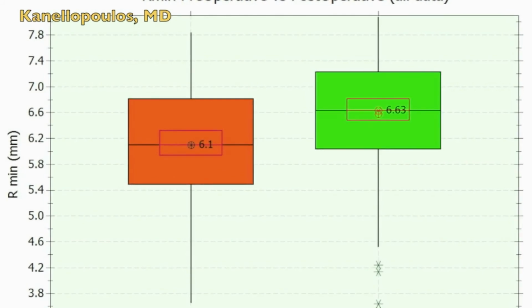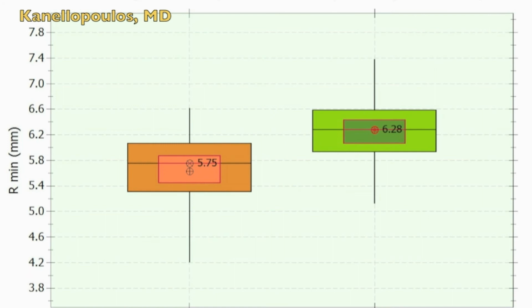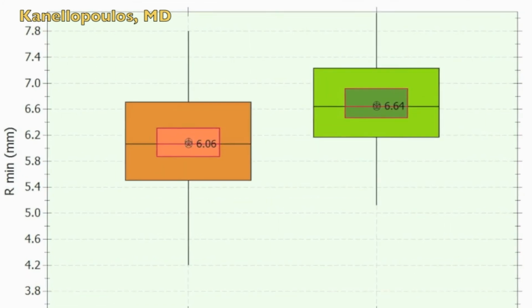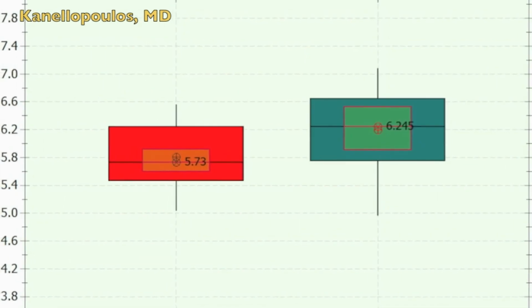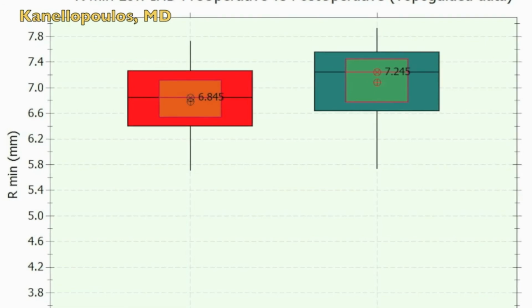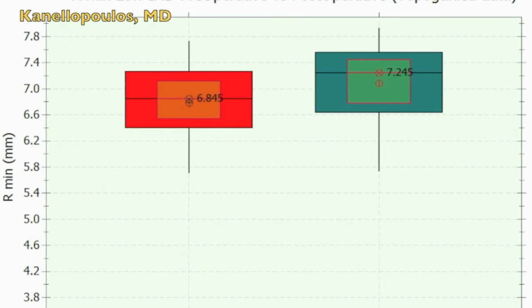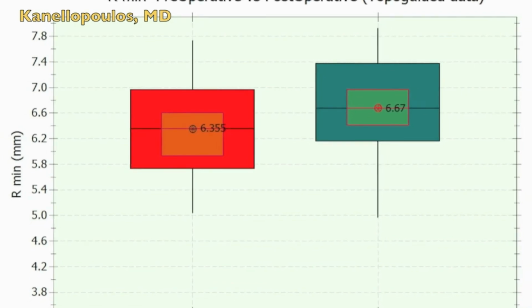Very illustrious statistics involved here with the help of my associate George Asimellis, who's a PhD in physics. We were able to put the definite proof that not only this procedure with very long follow-up gives very effective treatment, but the pentacam-driven ones are better.